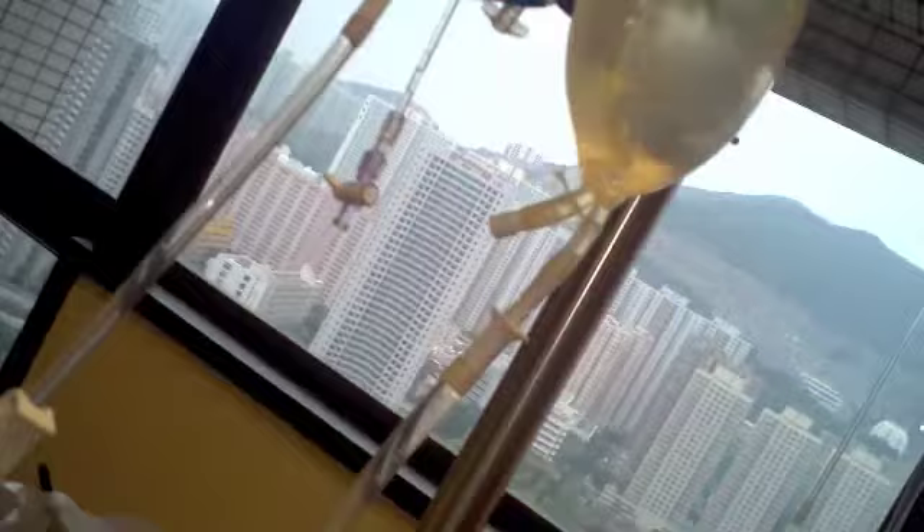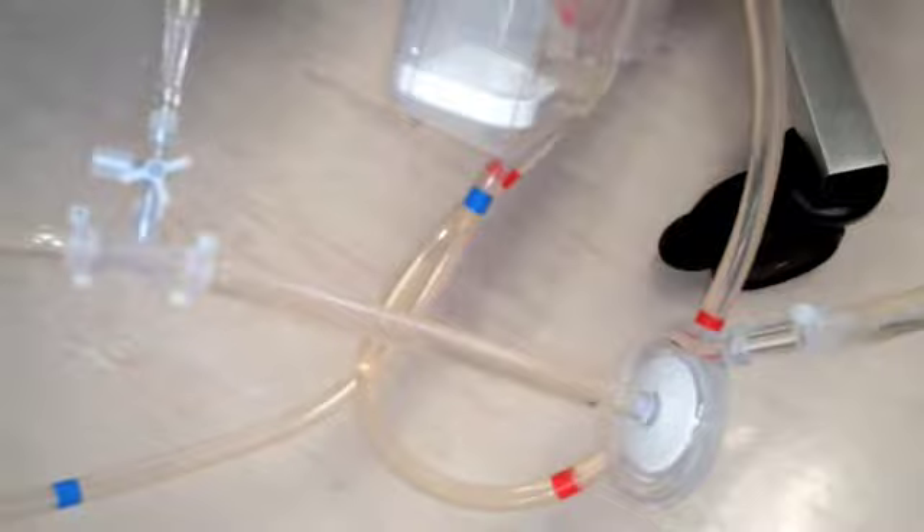Now the centrifugal pump and the oxygenator are filled. We now revisit the whole priming circuit again so that every candidate has a thorough understanding of the circuit and to make sure the connection is correct. As you can see, the extension line is already connected to the oxygenator.